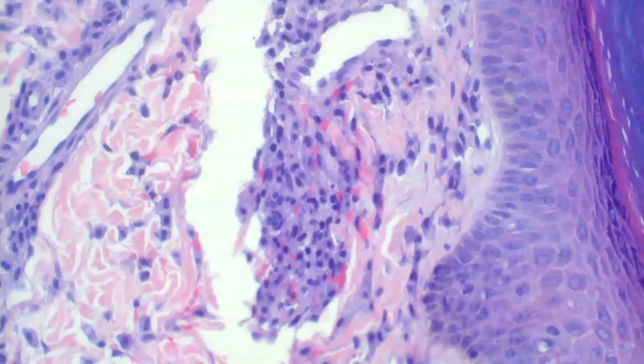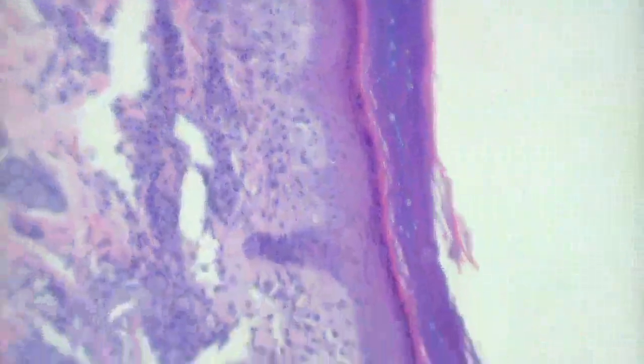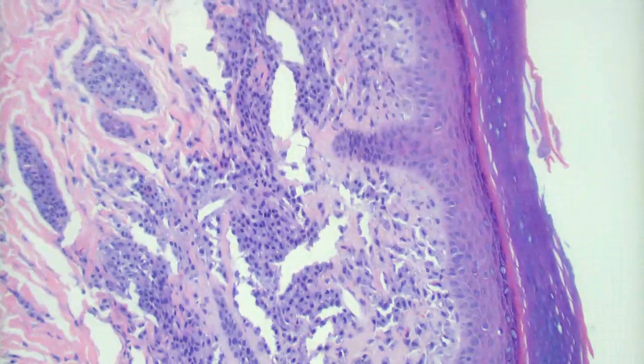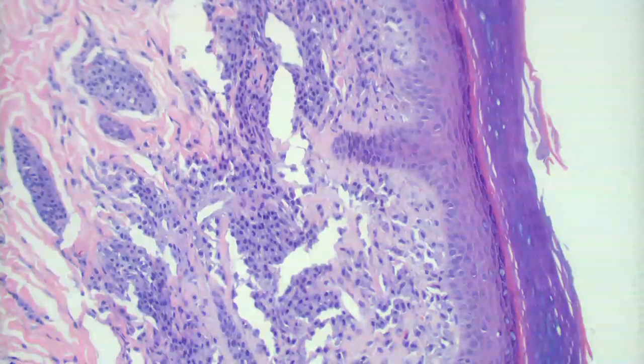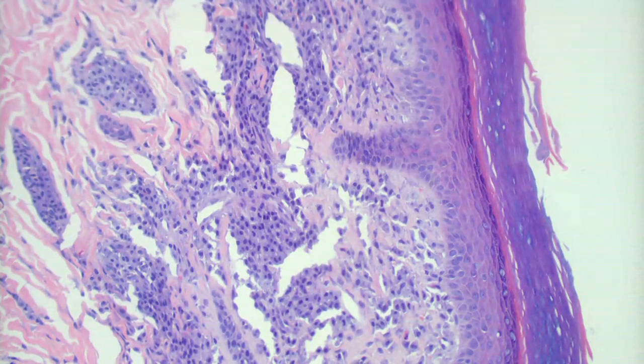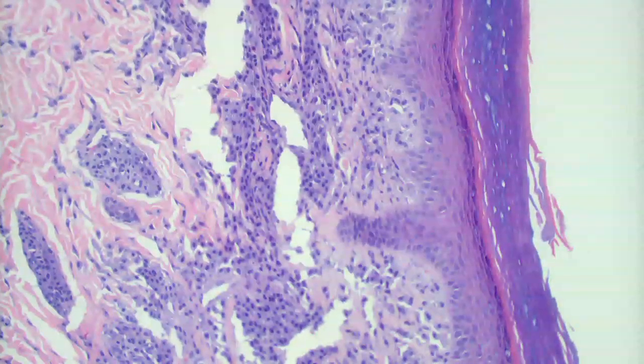So what's the diagnosis? Cutaneous mast cell disease. It might be urticaria pigmentosa. It's probably not a large mastocytoma, those are usually very dense diffuse infiltrations, lots of mast cells. It's got quite a few mast cells here. I wouldn't say, let's see how many Darier signs we can elicit on this patient. You might put them in anaphylactic shock, so be careful of that.